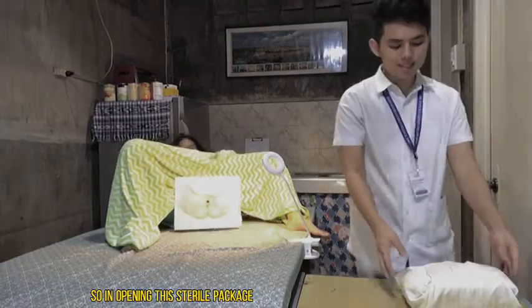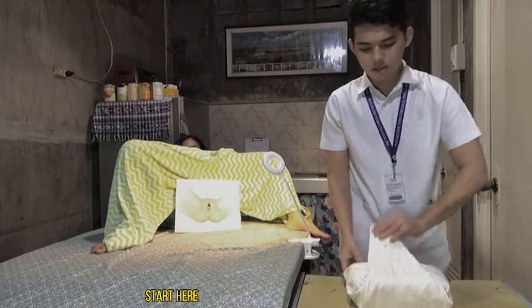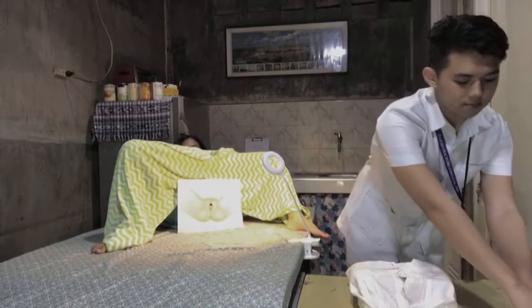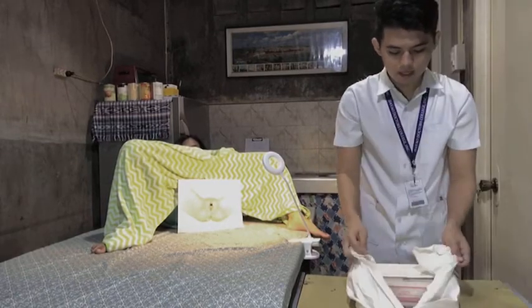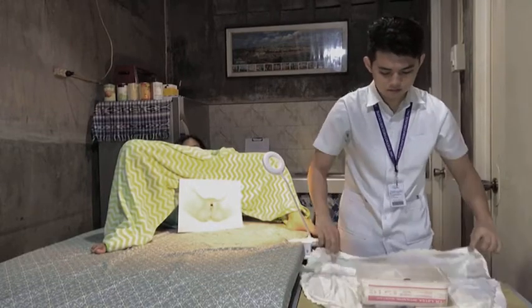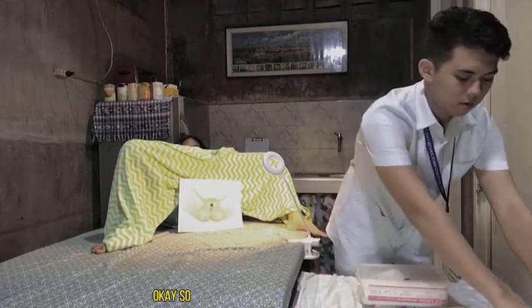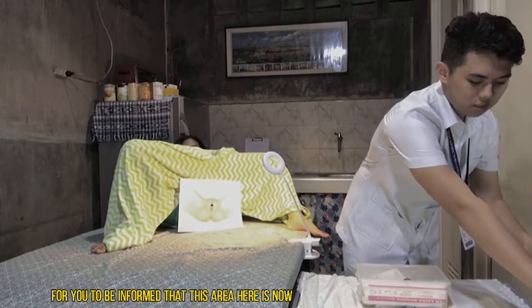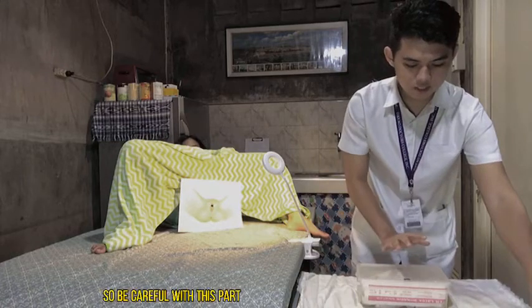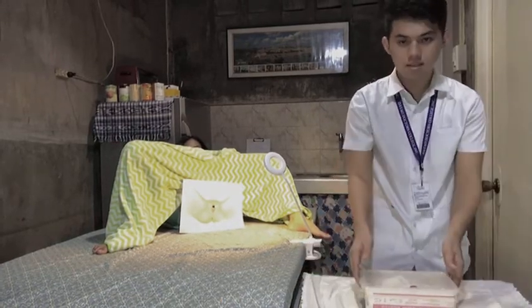So in opening this sterile package, of course, start here and then here and then here. Okay, so for you to be informed that this area here is now all sterile, so be careful with this part.